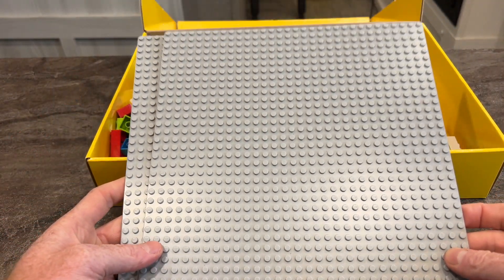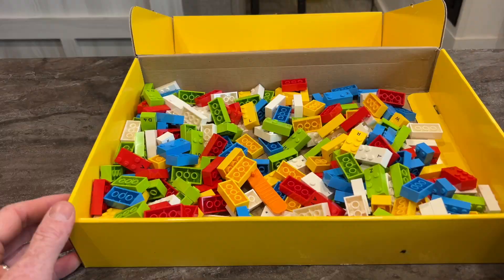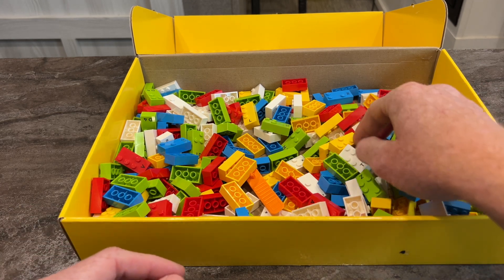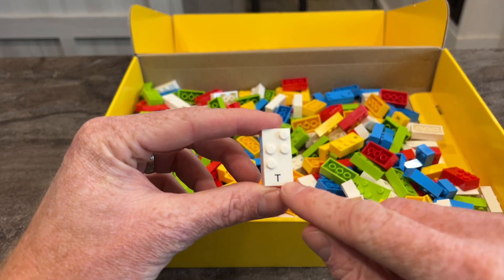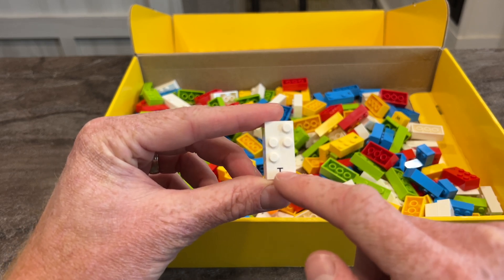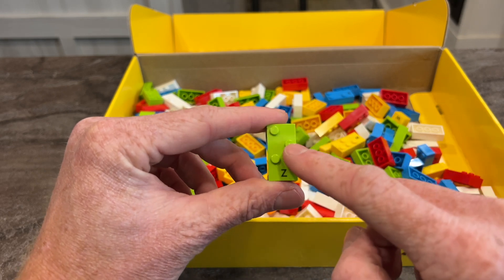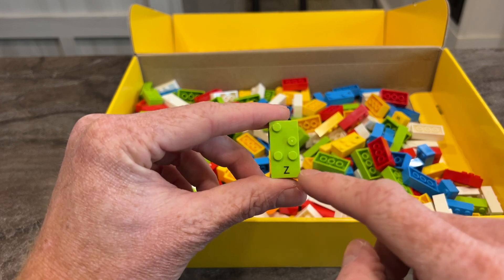Inside the box there are two gray building squares where you can put the pieces on, and I'll show that in a second. Underneath that are all the different pieces scattered about — they do come in plastic bags but those are long gone. Here we have a white Braille brick representing the letter T. It has the raised bumps like you'd normally find in Legos, and then a print letter T on it. And here we have the letter Z — printed Z, and then it has the dots using the Lego bumps representing the letter Z.